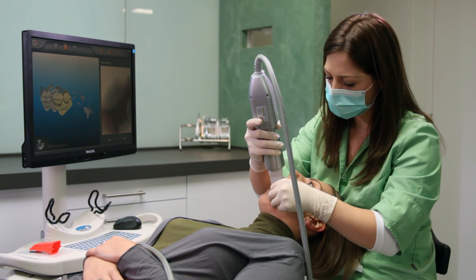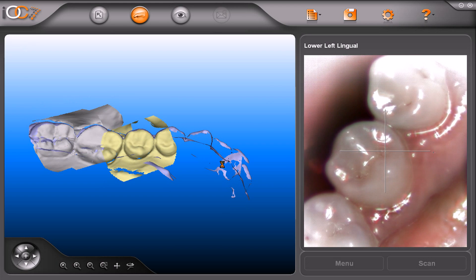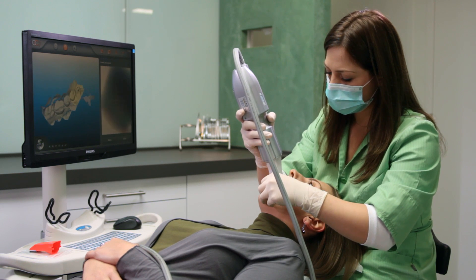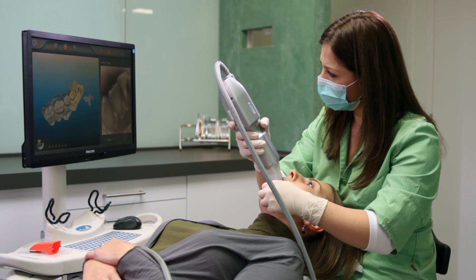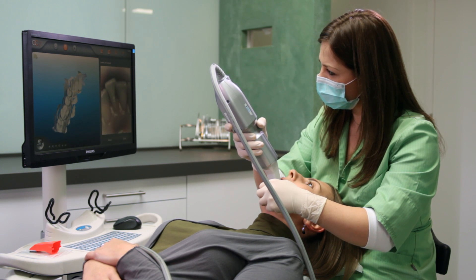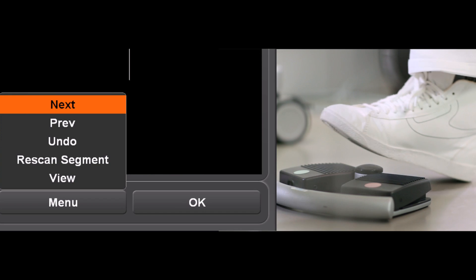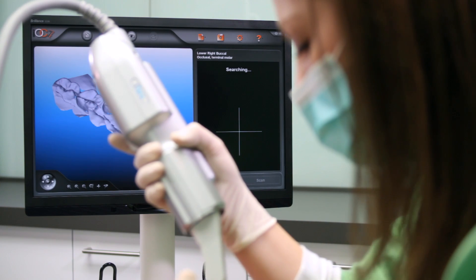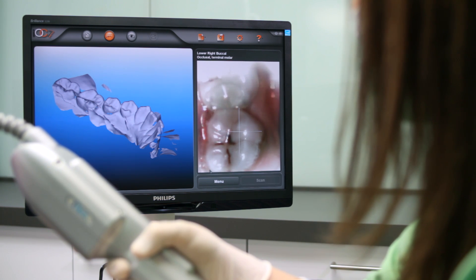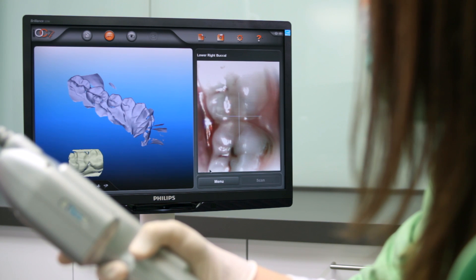The teeth are basically going to move diagonally across the viewfinder. Now press the green pedal to say next segment and move to the right side. Repeat the process on the right side, beginning with the occlusal view and rotating to the buccal, pressing the green foot pedal to take a scan.